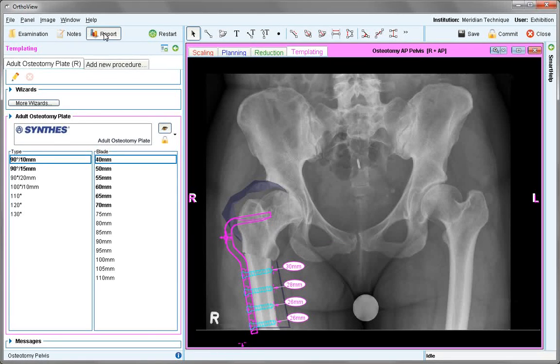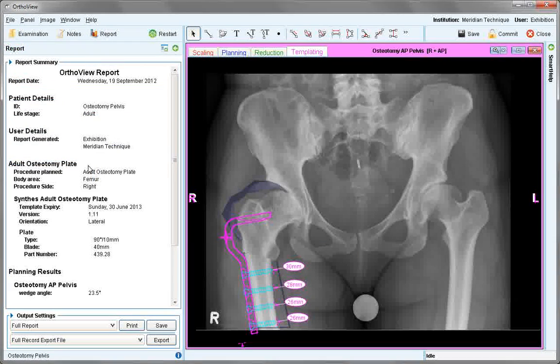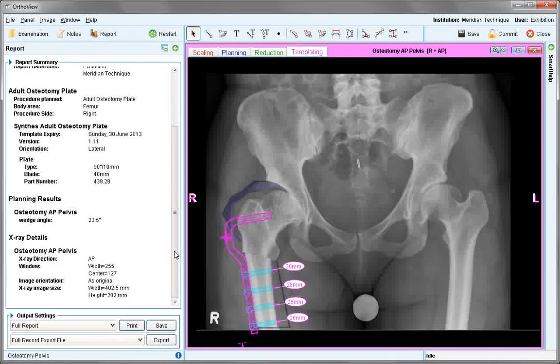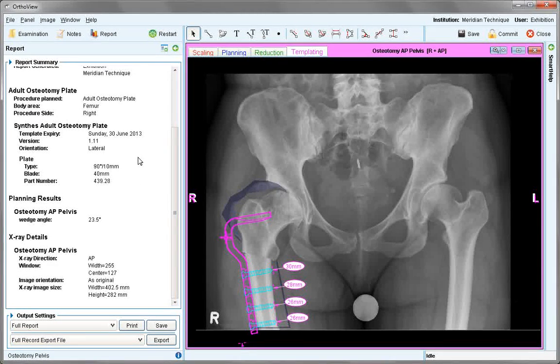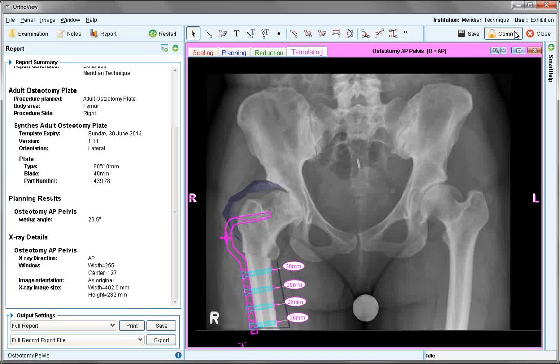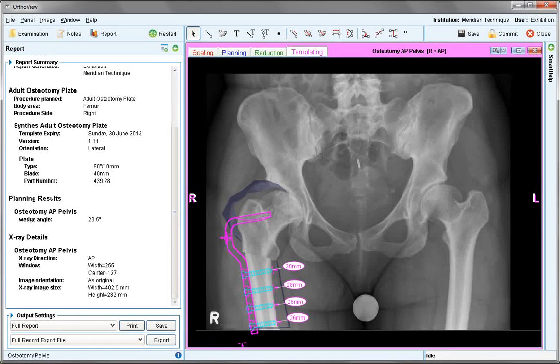If we look at the report, we'll see that the wedge angle has been recorded, plus plate size and any other information. When satisfied, save or commit this plan to the packs. This ends the tutorial on proximal femoral osteotomy.